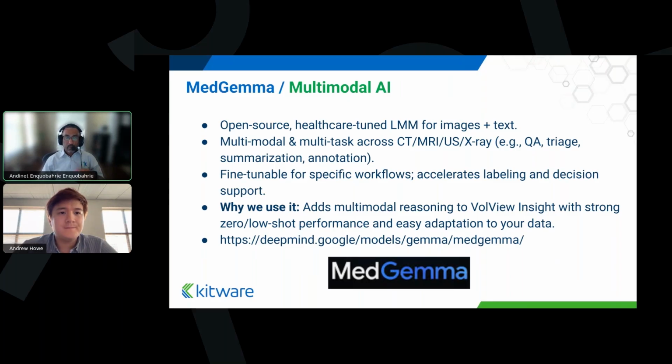We don't want to have only specific types of models, but rather any types of models people have developed, they can bring in. Again, the models could be proprietary, and then obviously your VolView Insight instance would be running on your own server, so those proprietary AI models could be used as well.